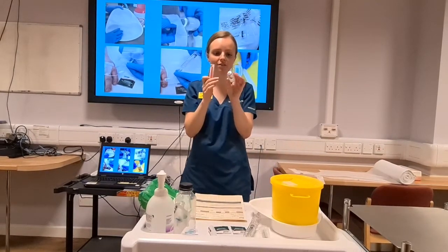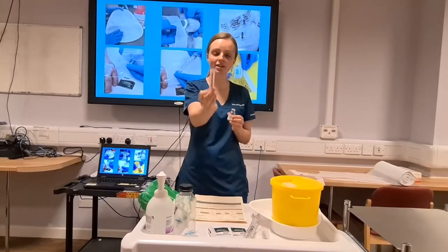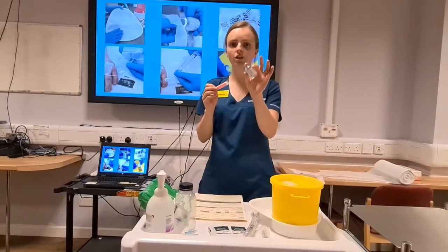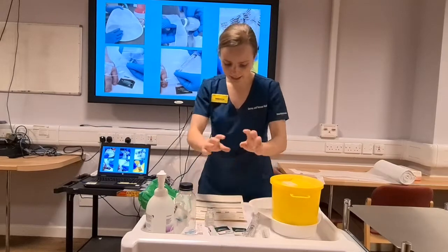combination with this one. I do not need to filter this vial but I do need a needle with a filter if I'm using a glass ampoule, so that I can filter any glass out. Right, so that's all my equipment.